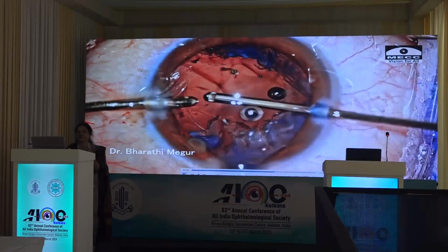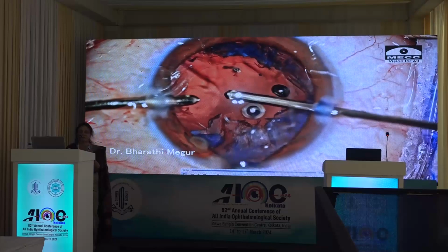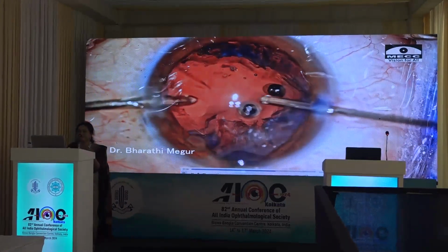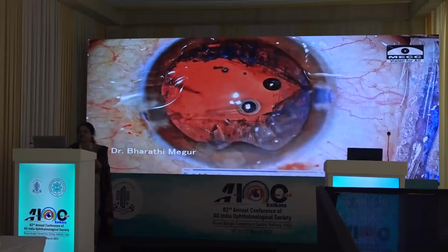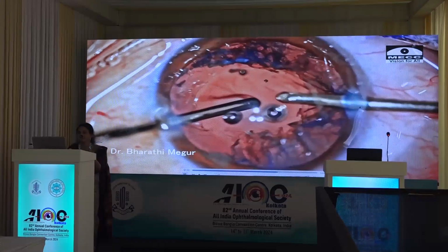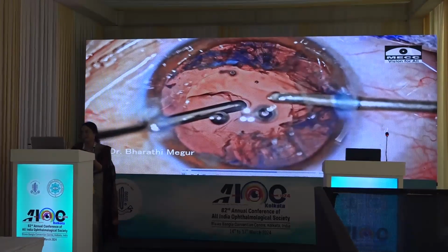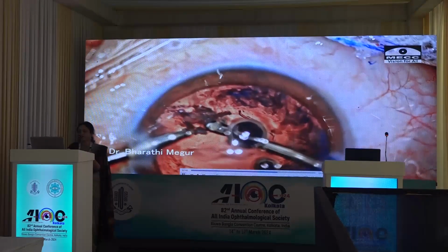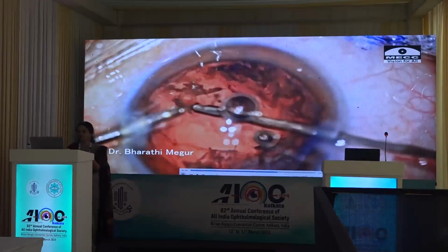Invariably, these cases are going to consume a lot of surgical time. You have to be mentally prepared for these cases where the time consumed for each case is going to be longer. So each of the steps have to be taken meticulously and managed carefully. The cortex removal is being done.